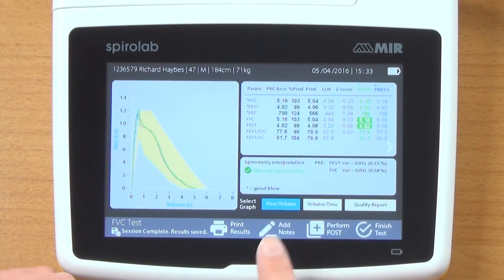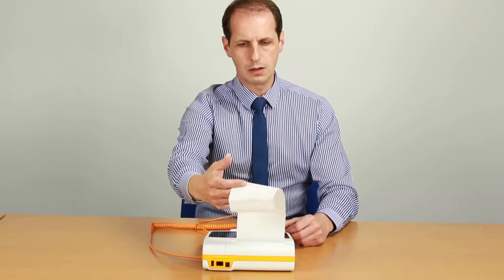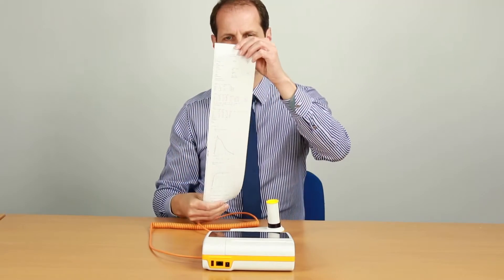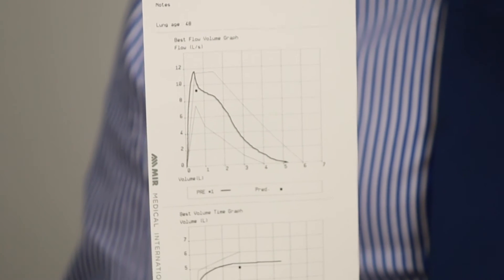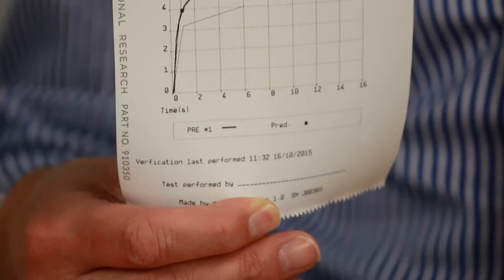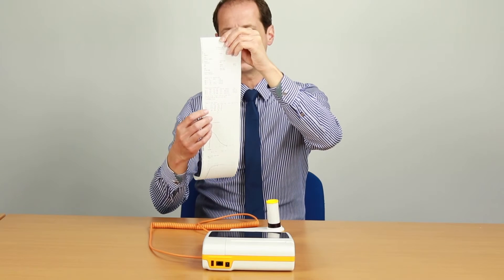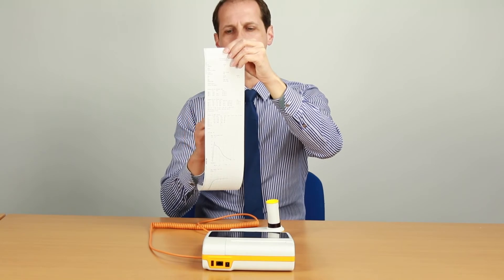Down here we get the option to print the results, add notes, perform a post-test, or finish the test. I'm going to print the results — the printer is really quick and prints both graphs in very high definition. The printout shows patient details, the test performed, results for the best test compared to predicted, and the graphs with the predicted area. At the bottom it tells you when the spirometer was last verified using a 3 litre calibration syringe. For ratios on the printout, you just get the actual ratio — not the predicted value, lower level of normal, or percent predicted — which is essential for not getting confused.